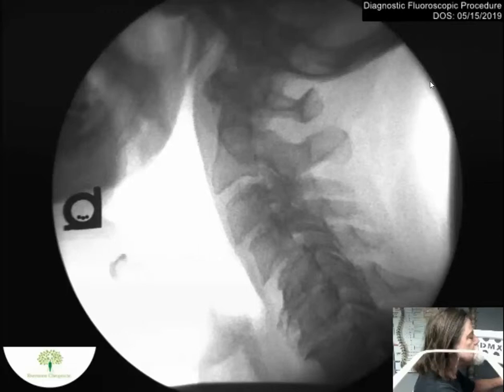So right here we have an image of the neck. This is the lateral version. In a second I'll hit the play button and you'll see this patient looking up and down for flexion extension. For the cervical spine, for the neck, we do 7 different movements. This puts stress on different segments of your spine and also different ligaments, so we can see if there's any ligament damage. We can also pick up different views to see if there's a hidden fracture.